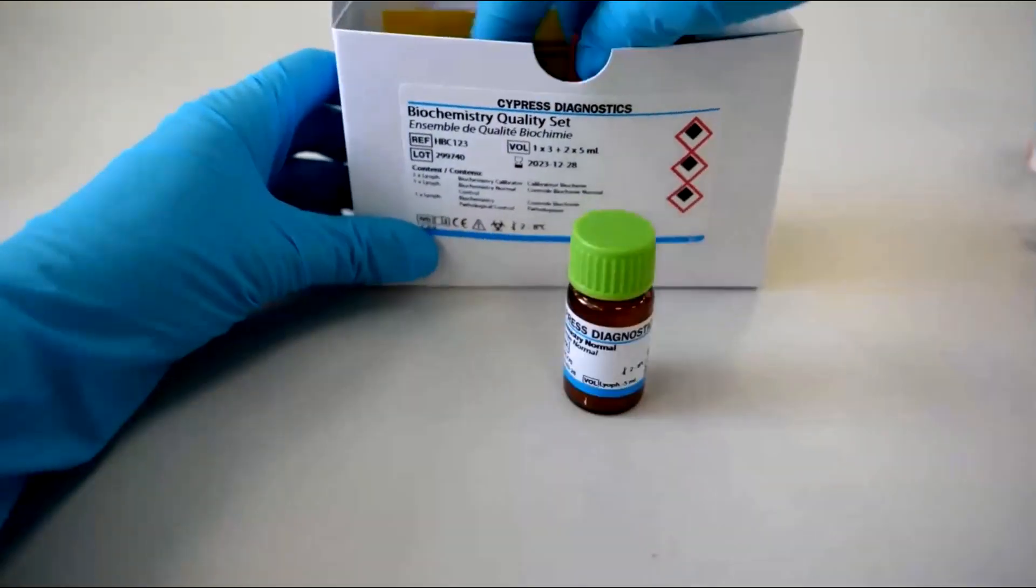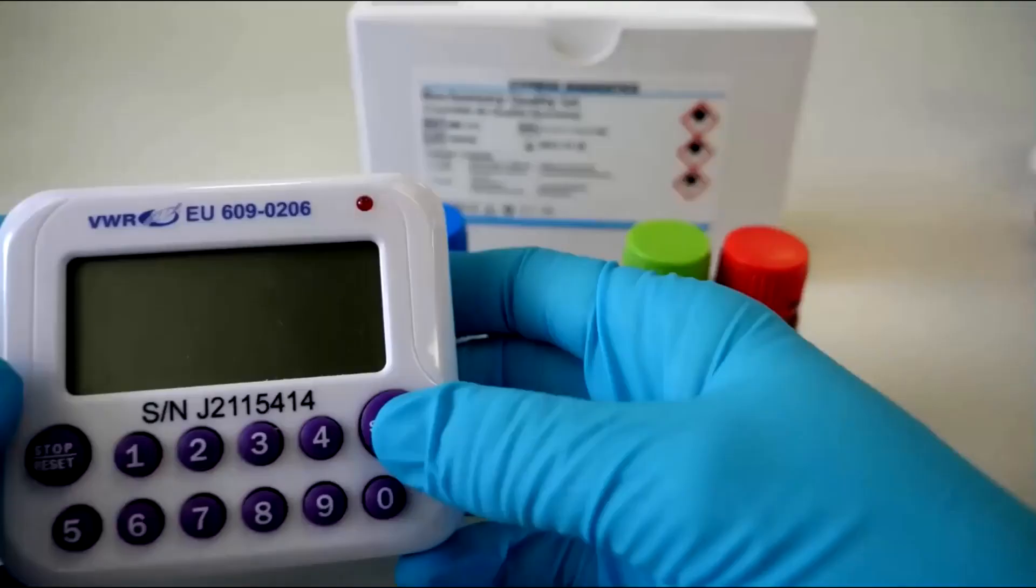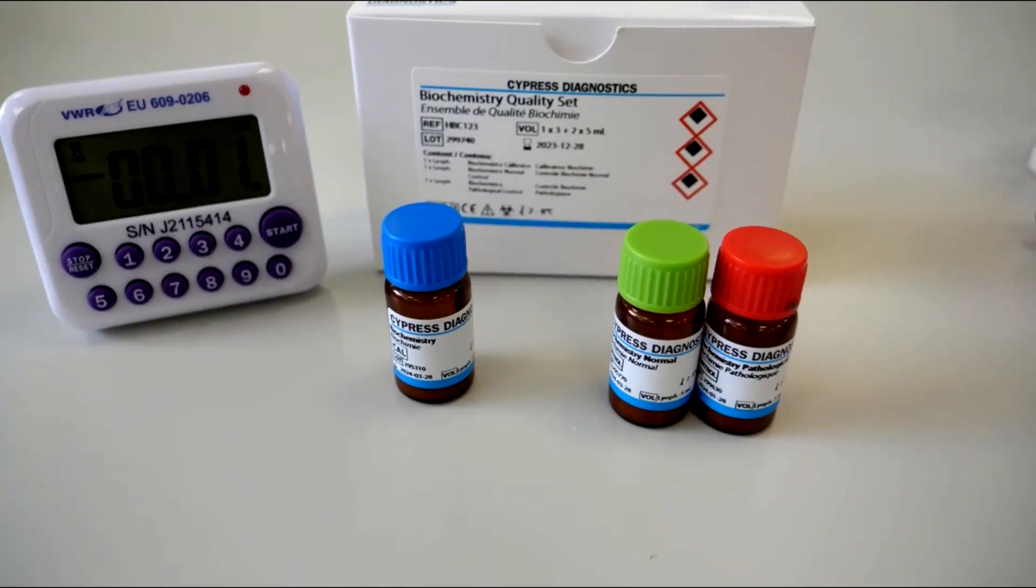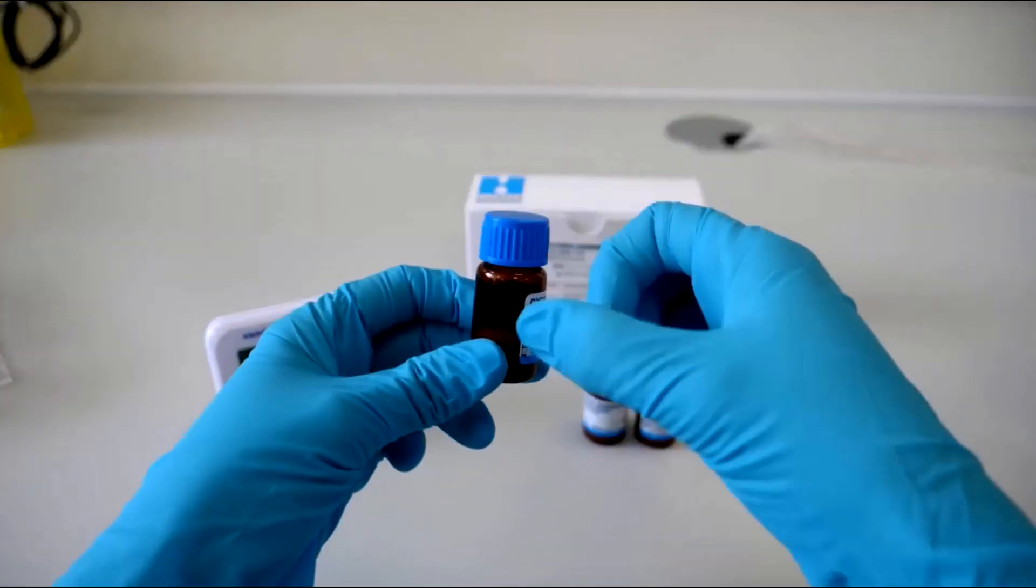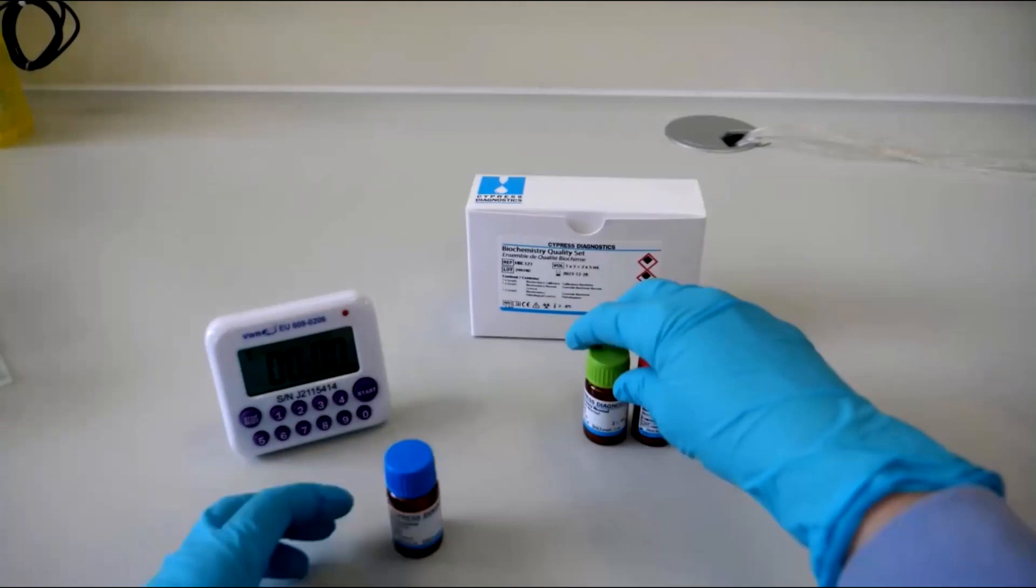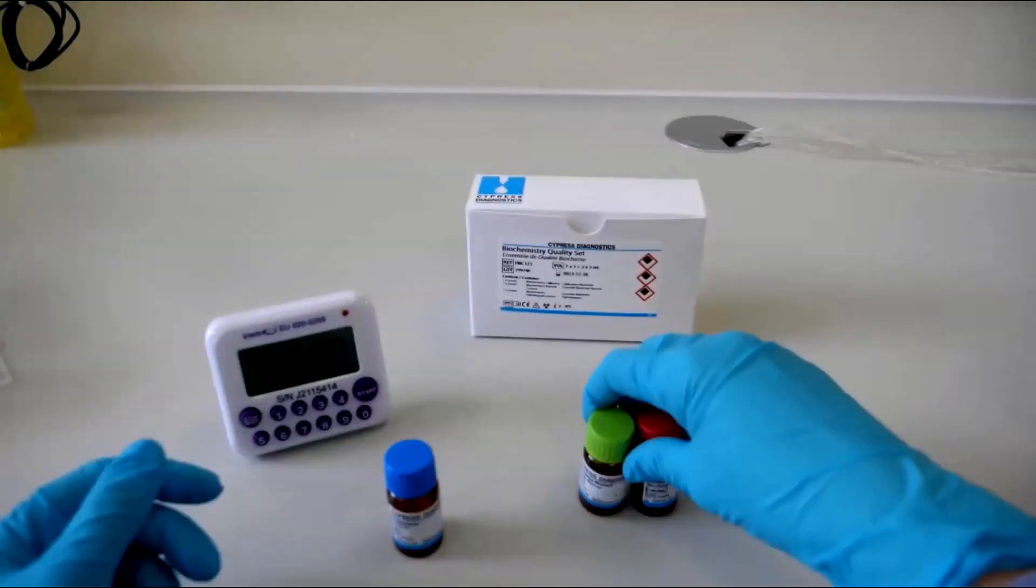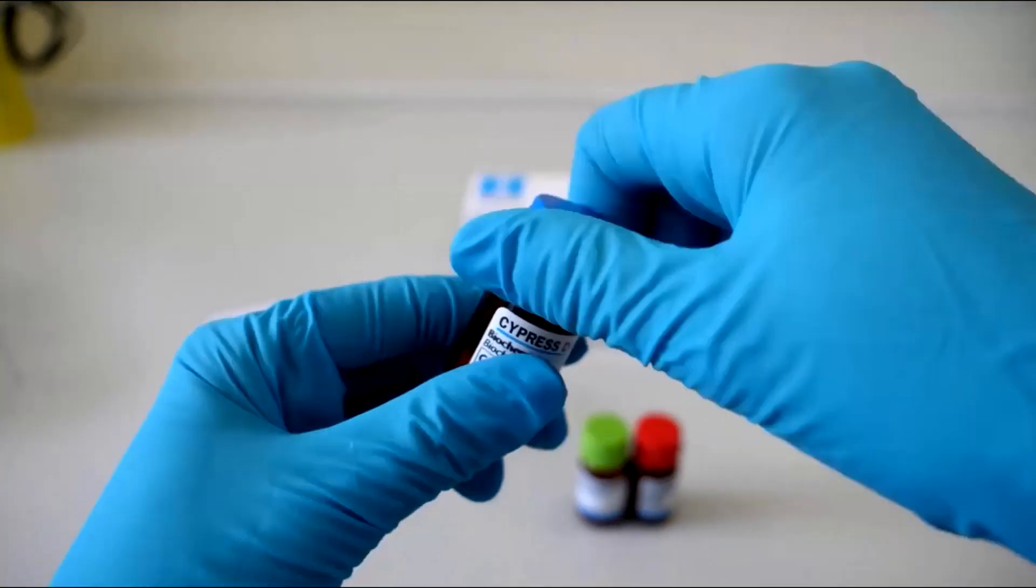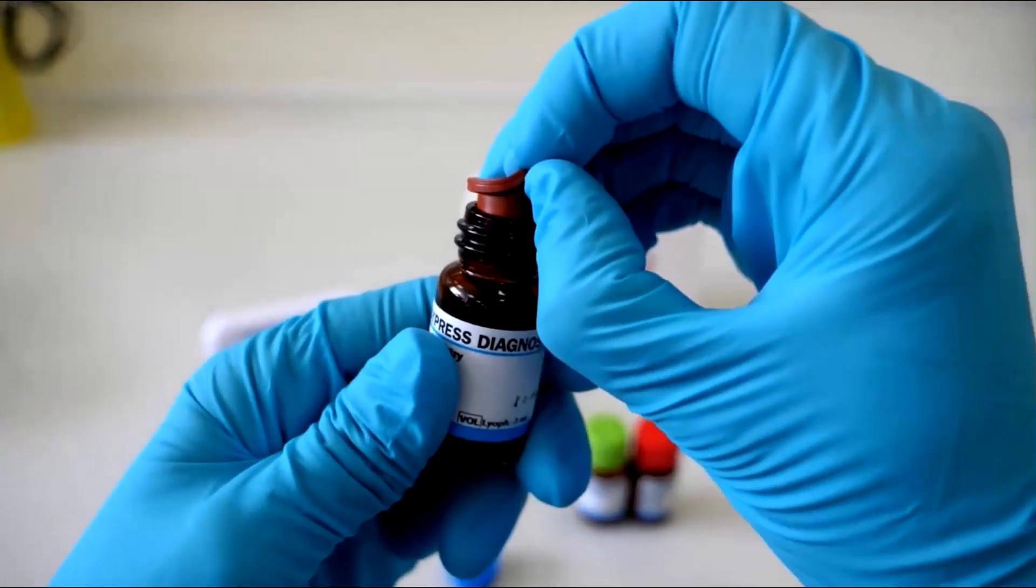Prepare the calibrator and quality controls as follows. Bring the vials to room temperature for 30 minutes. Gently tap the vial to make any material fall from the rubber cap. Open the vial carefully. Make sure not to spill any lyophilized material remaining on the cap.